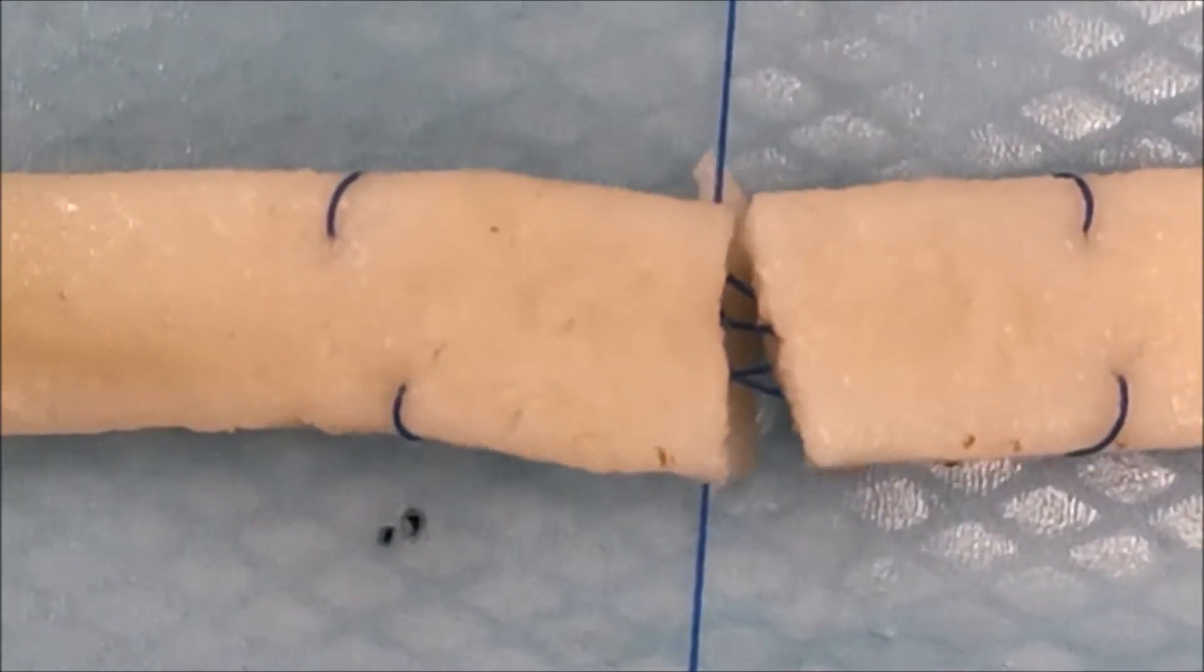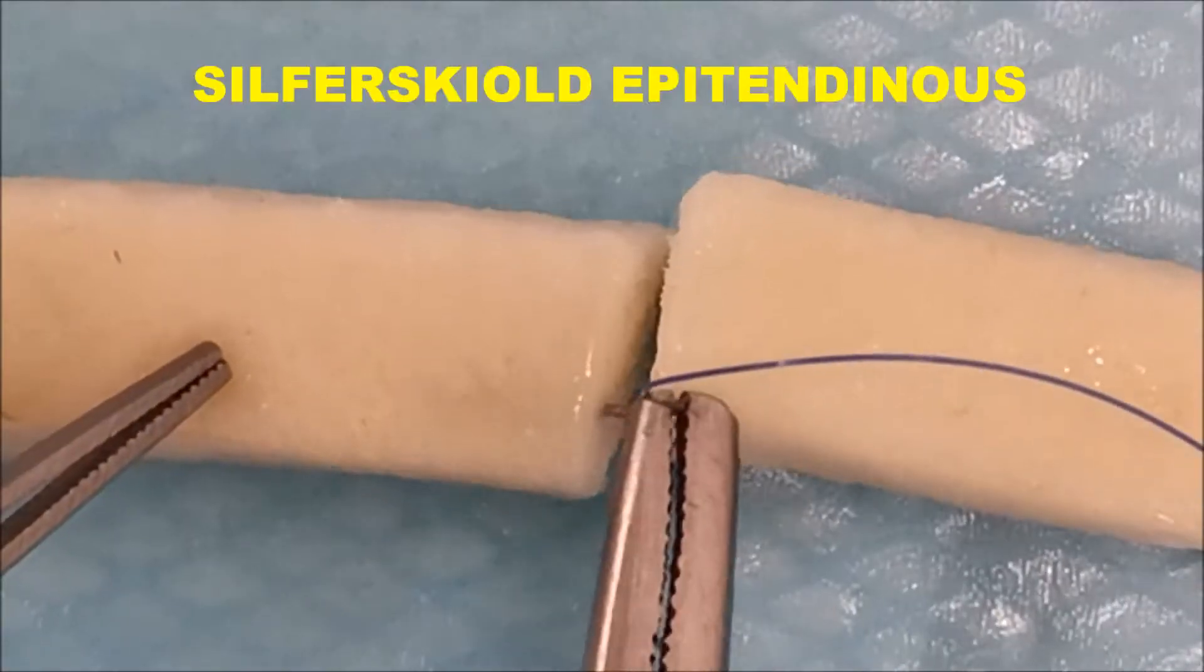Tie the knot and ensure that your tendon comes together.